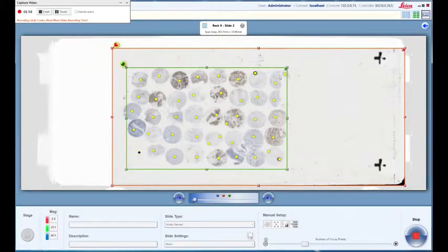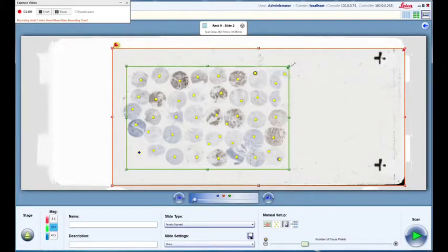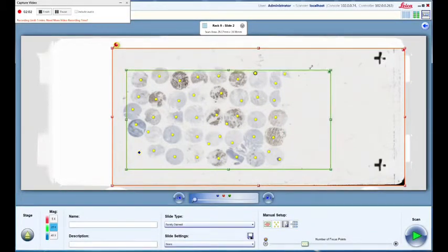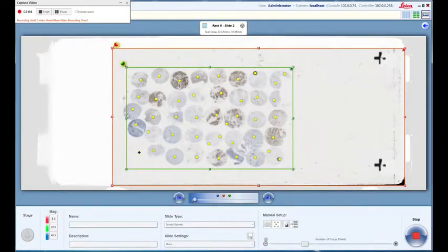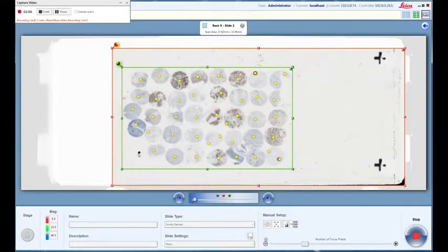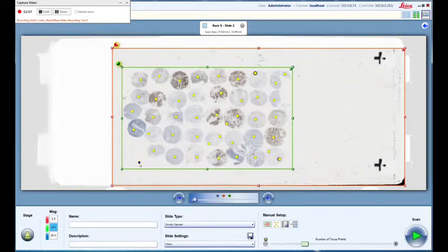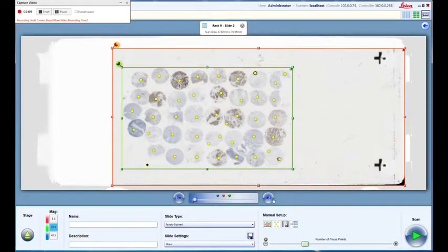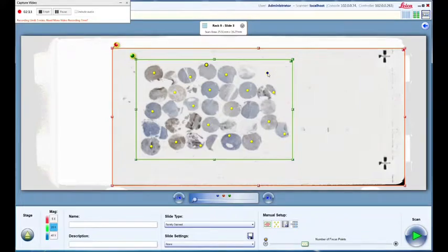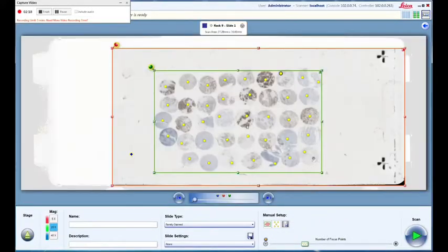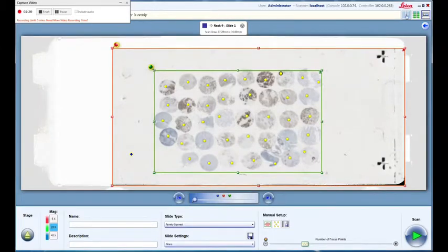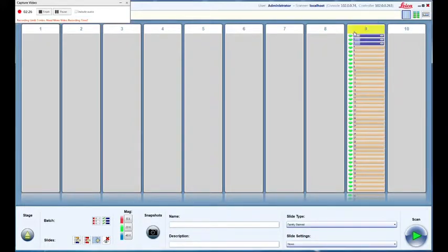You can actually move the green box by just grabbing on the corner and pulling it around like this, so if you need to make some fine adjustments, that is the way to do it. If you see that I pulled on that blue diamond there, that is the relativity point. You want to place it on a clear portion of the slide.